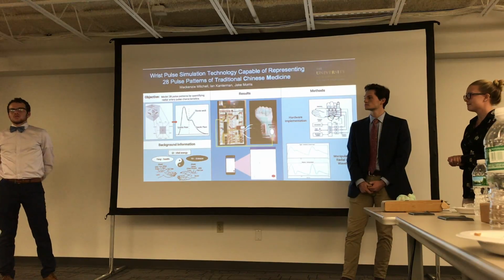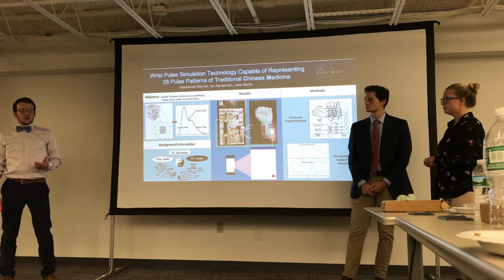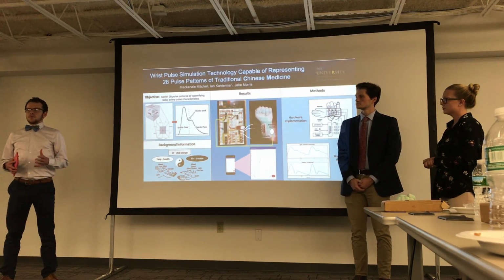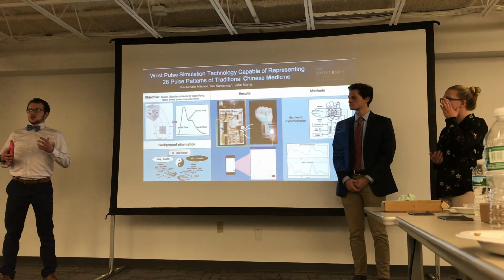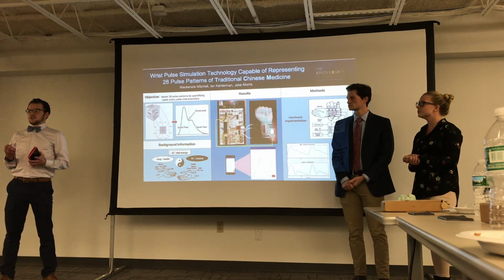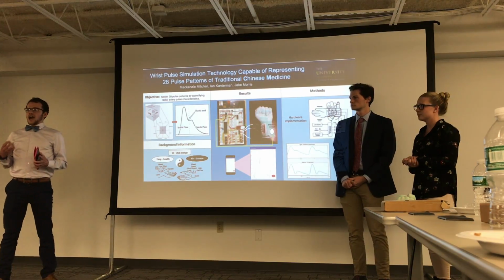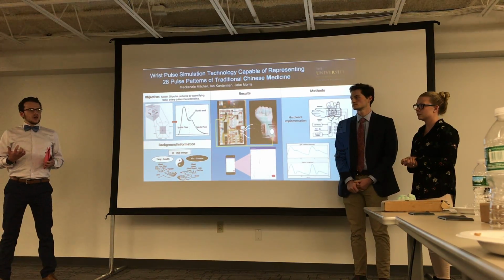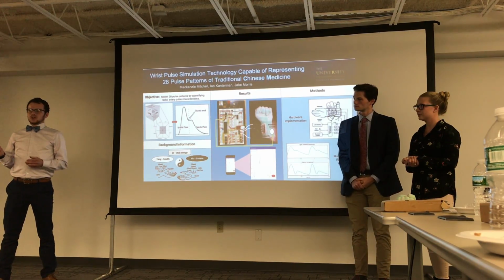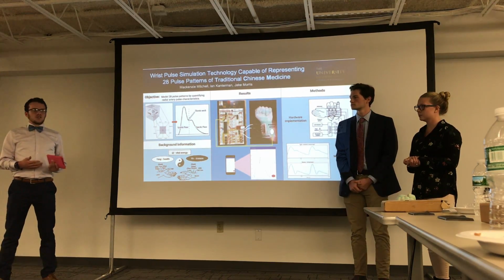In terms of the goals, we are building upon the last group. We are currently the 3rd rendition working on this PulseSim project. Just to recap what the last group has done already, they created a silicone hand model with a wrist, a compartment inside it with electrical solenoids that are driven by current and are used to actuate the feeling of a pulse. In addition, they created an Android app called PulseSim, shorthand for Pulse Simulator.